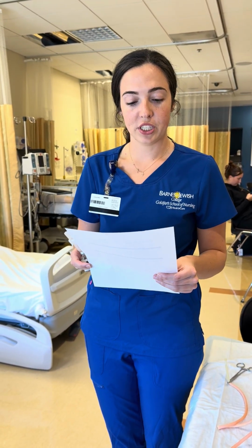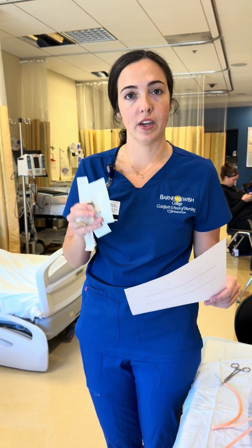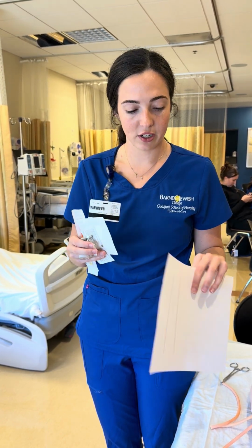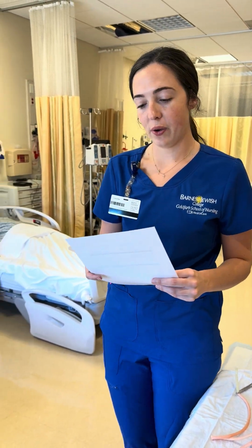So I'm going to go ahead. I have got my medication here. I have verified that I'm doing my first med check, so I've got everything here that I need. And then I'm going to go in the room. Everything is unopened and nothing is expired. So go ahead and go in.